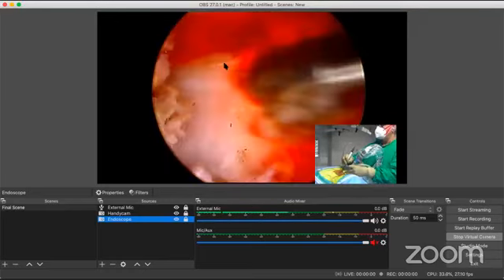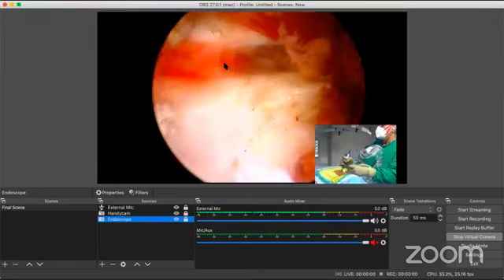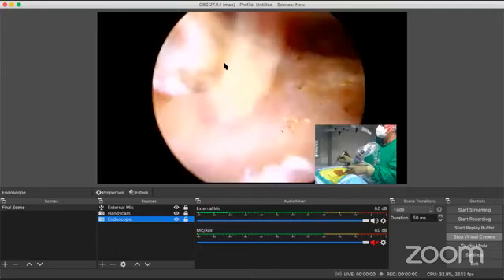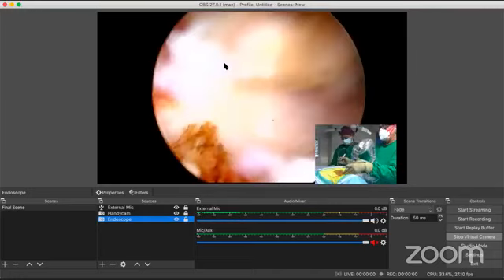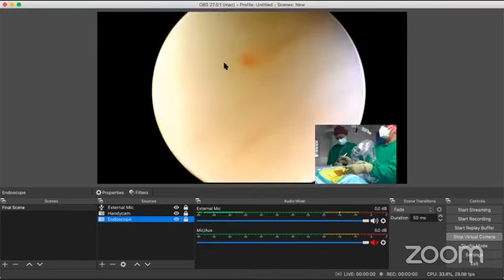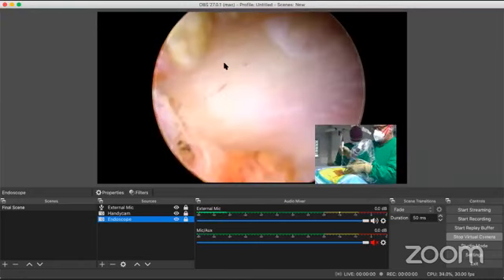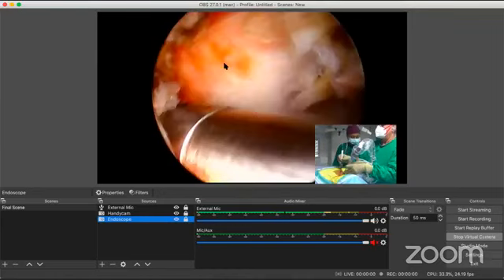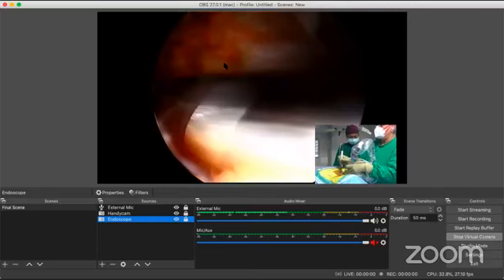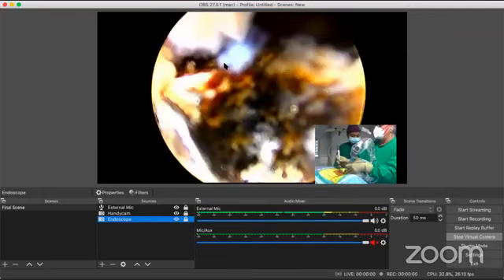Yeah, thank you. Can somebody stop please for a second? I just want my probe cleaned. You can see how nice the bone surface is being seen now. And I think this is the spinolaminar junction that I want to be at. Can somebody fire please for me? Yellow.